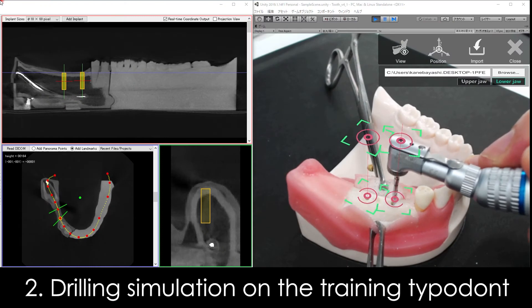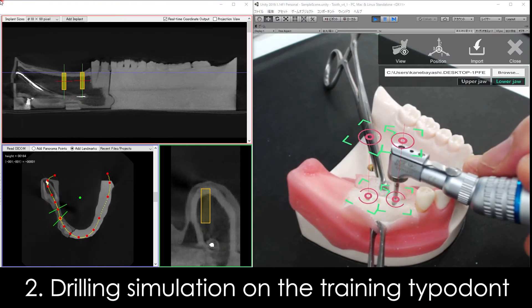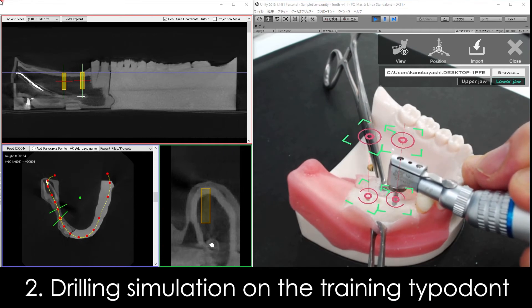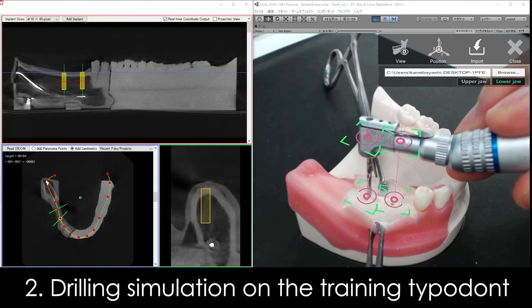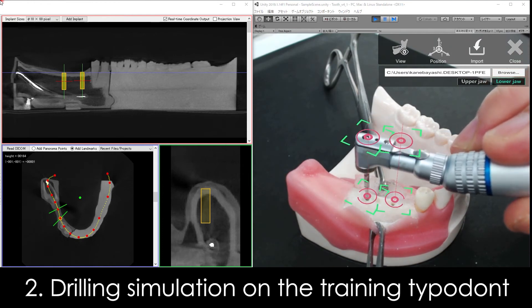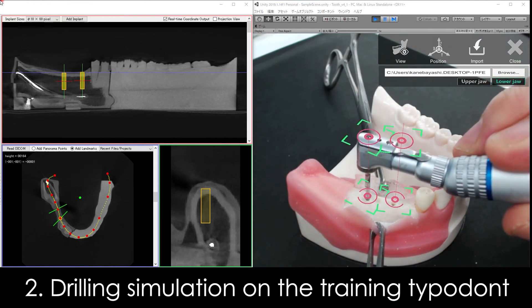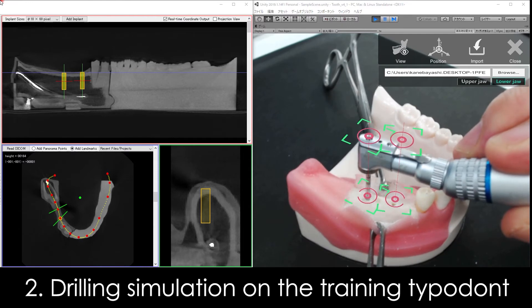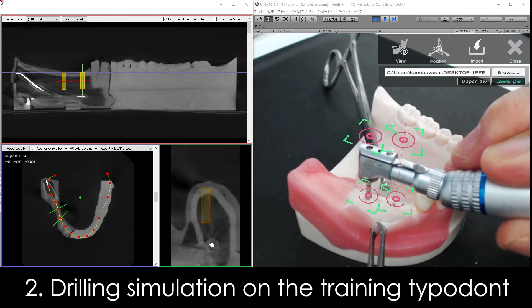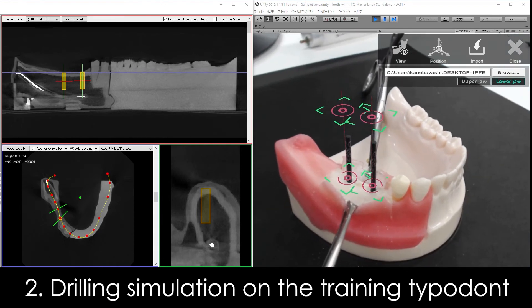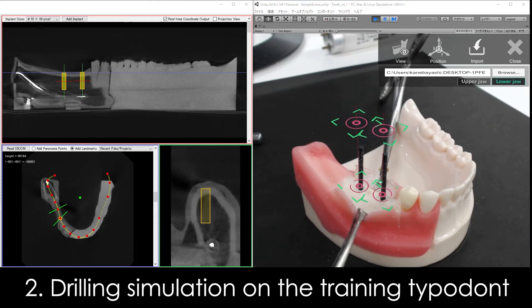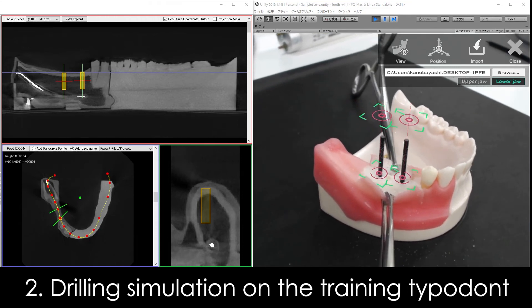Set the apex of the drill at the starting point, and set the tail of the drill at the center of the guide ring, then start drilling. The second installing hole is drilled in the same way. Drilling simulation on the training typodont showed a good performance of our system.